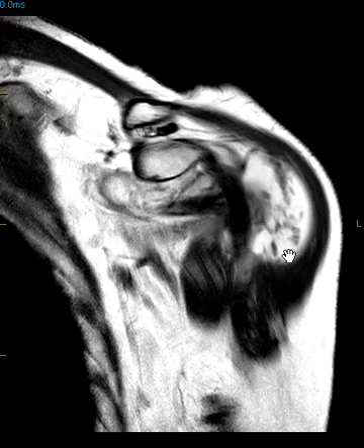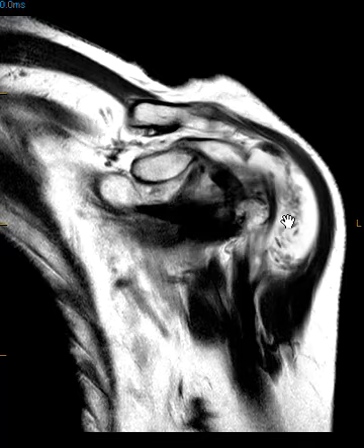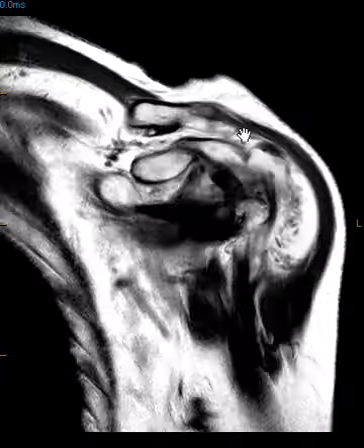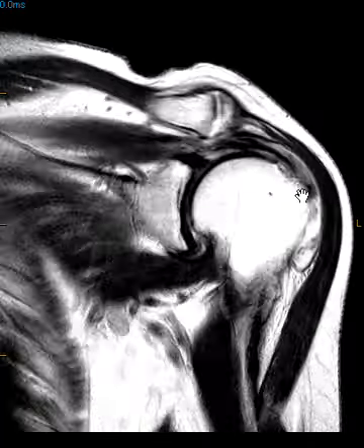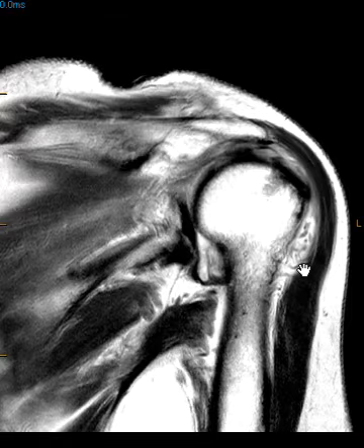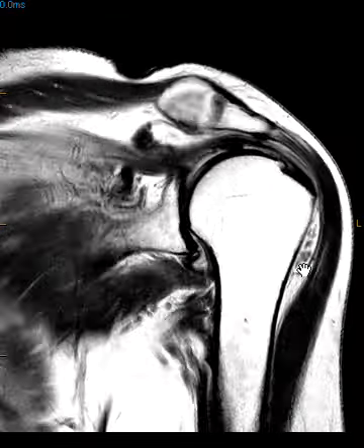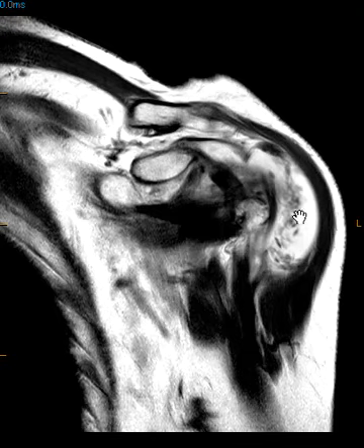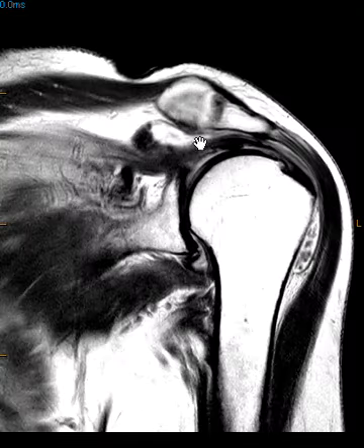This is a really great example of rice bodies — classic for rheumatoid arthritis. You can see these little nodular specks all throughout this significantly distended bursa. This is a synovial inflammatory process, most likely rheumatoid arthritis. They look just like little rice particles here.